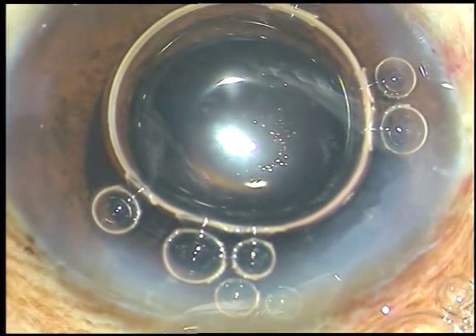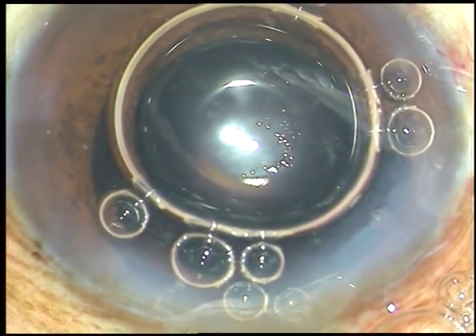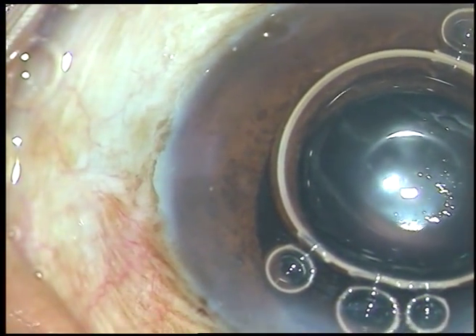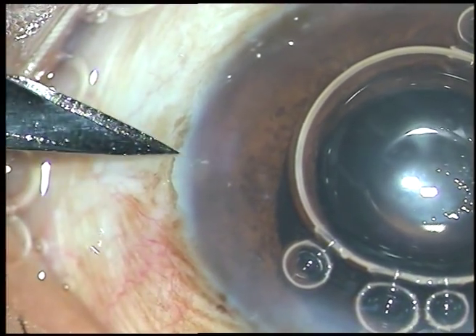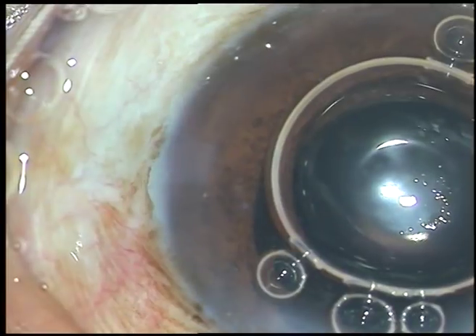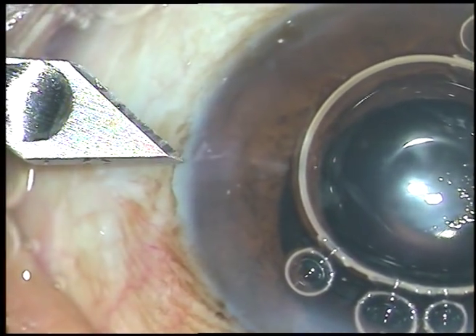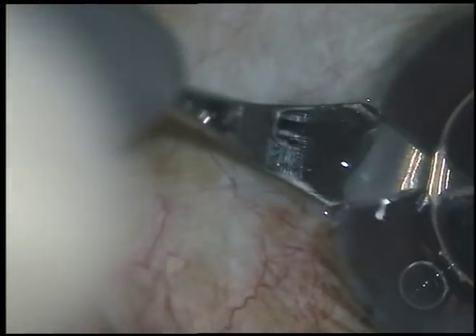The side port that I made at 4 o'clock is very small. I want to use this port for introducing the vitrectomy cutter, which is 20 gauge. So I want to enlarge this side port a little bit so that the cutter can go into the anterior chamber easily. This much is enough.